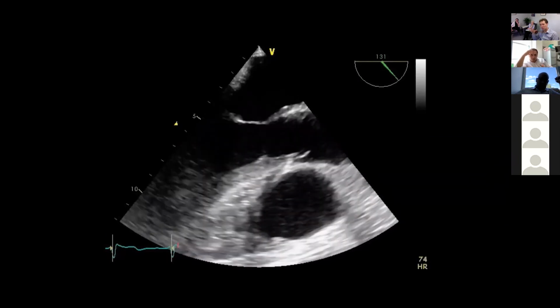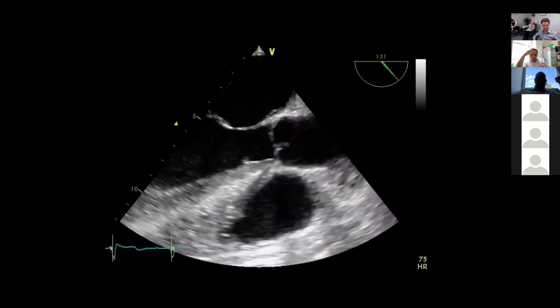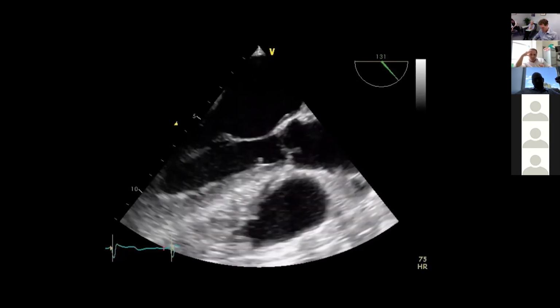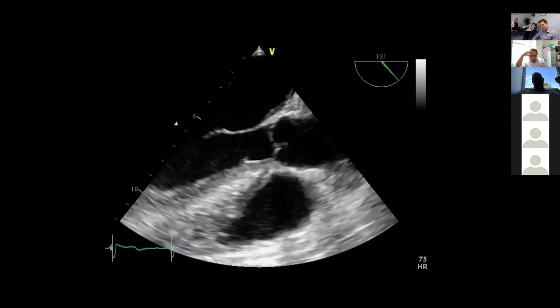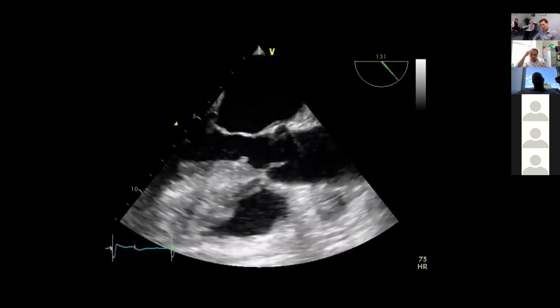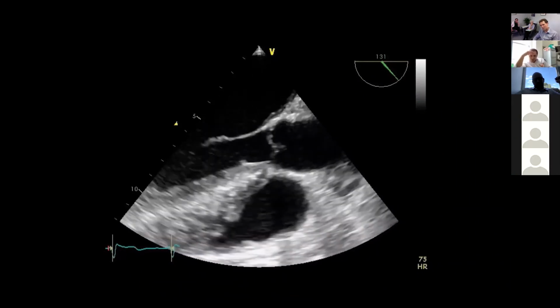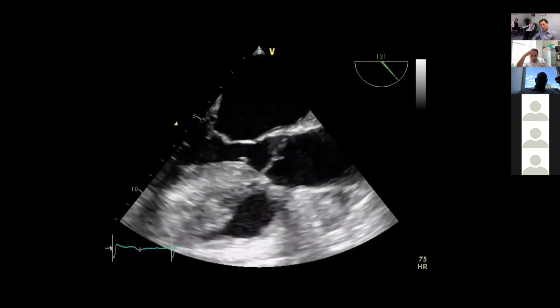She's just walked in off the street. She's fine. She's got no infective symptoms at all. So, from the valve perspective itself, the valve is opening properly. But yeah. So how are we getting a gradient of 4 meters a second then? I think below the valve there's something that's concerning. There's something moving around it.